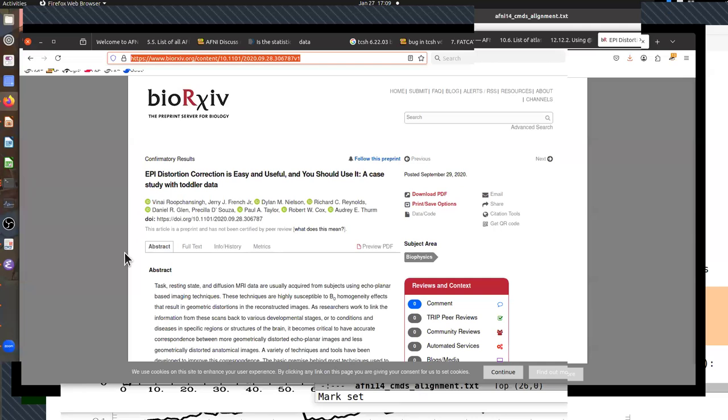What if the skull stripping is not good? Yeah, if the skull stripping is not good, it can present a challenge. Sometimes if the skull stripping isn't good for affine alignment, it might not affect too much because that's a global fit. If the skull stripping is not good and you're doing nonlinear alignment, now that becomes much more of a problem.